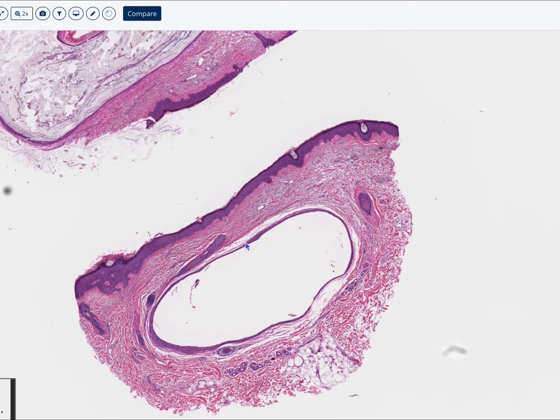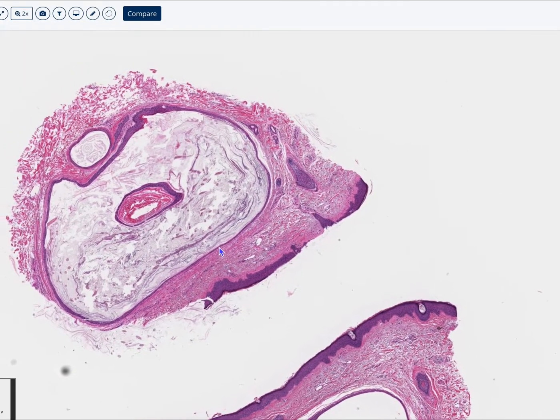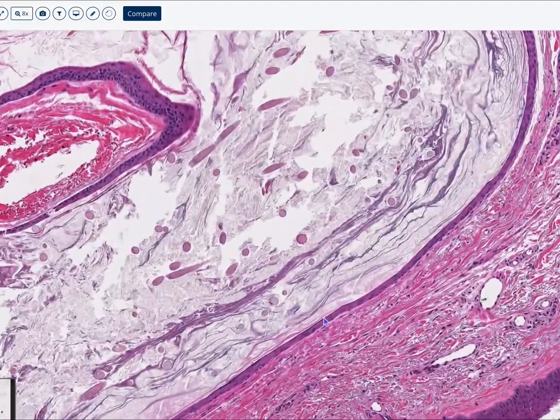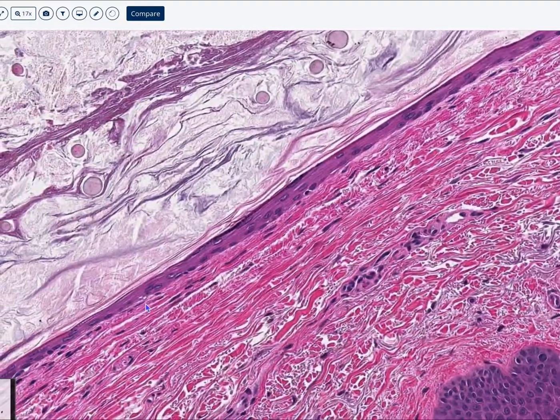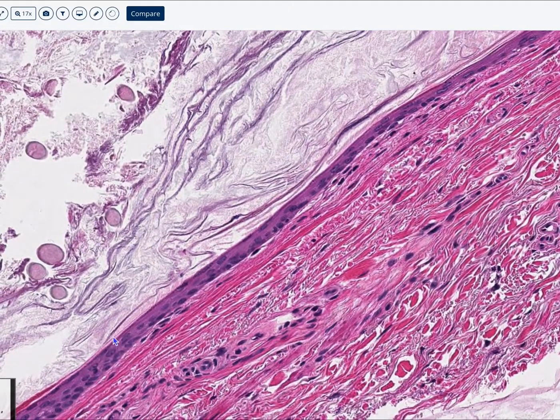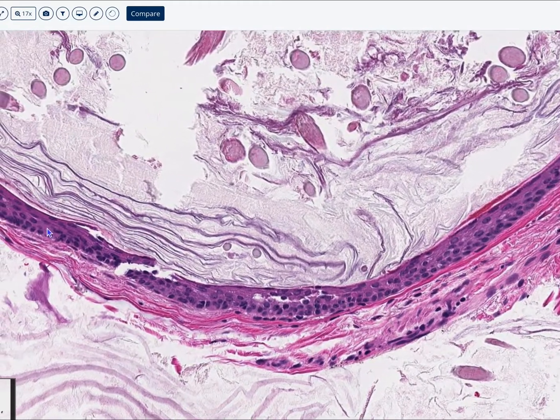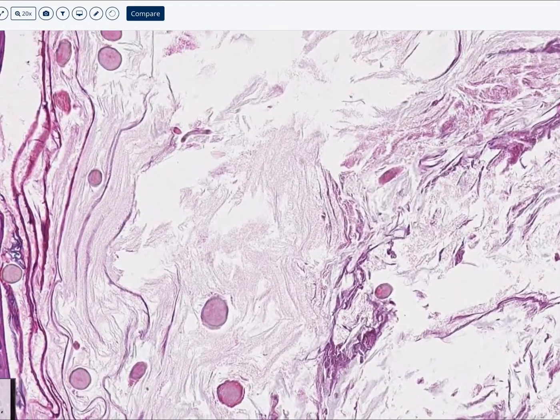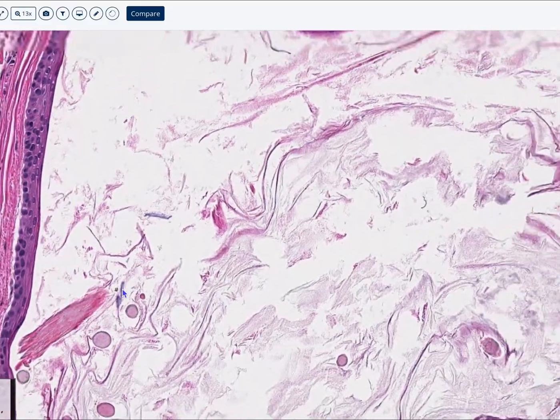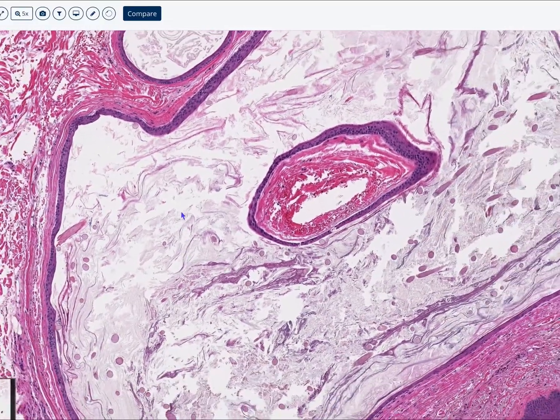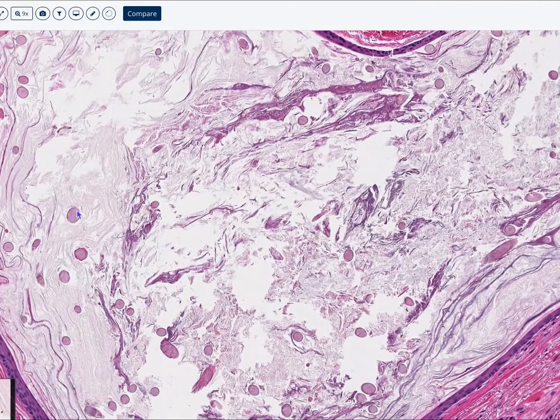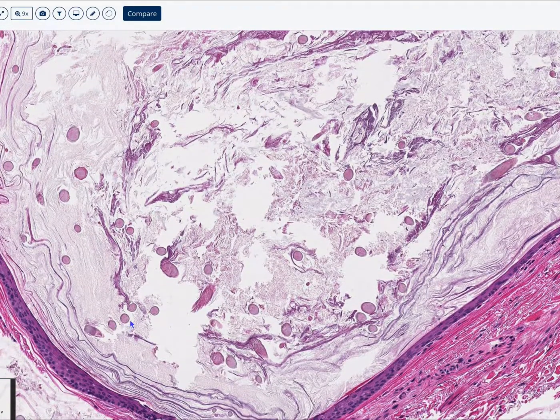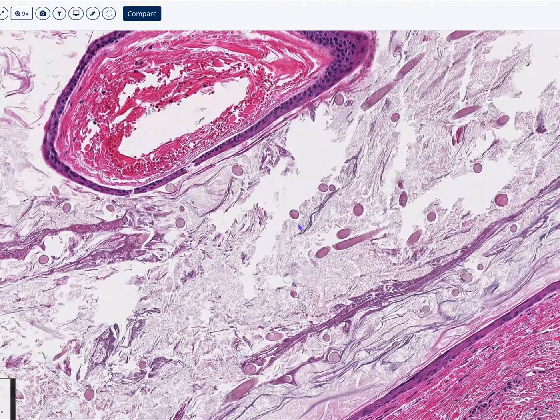They're usually closer to the epithelium, and when you look inside the cyst, the cyst lining will generally have a granular layer — that's because the infundibular portion of the hair follicle has a granular layer. This granular layer is not as prominent and is a little bit attenuated by the dilation of the cyst. But more importantly, to identify vellus hair cysts, you want to look for these very thin cross-sections of vellus hairs. Some cases won't have a lot, so you'll have to look more carefully, but this is a really great section where you can see a lot of these cross-sections of the vellus hairs.